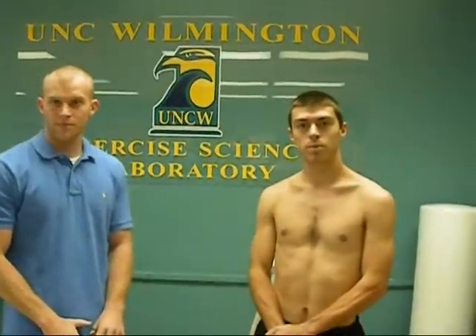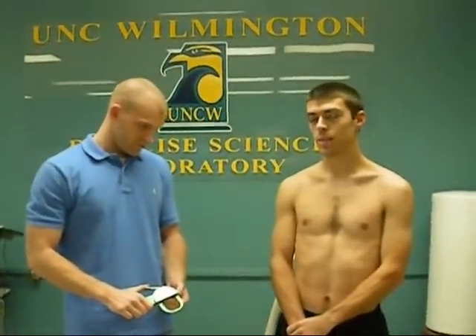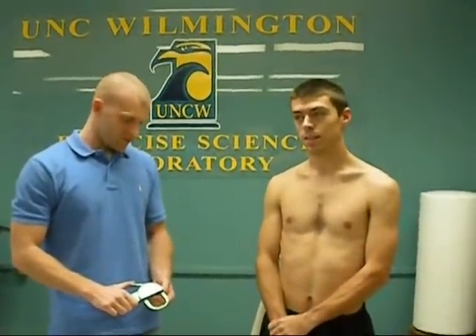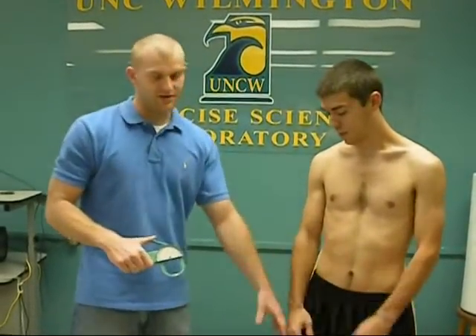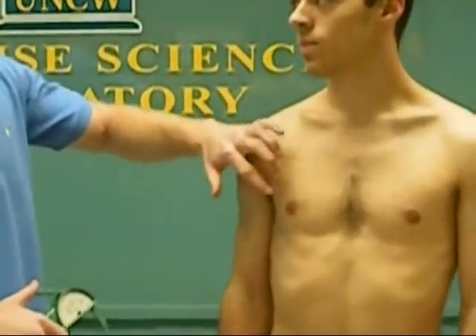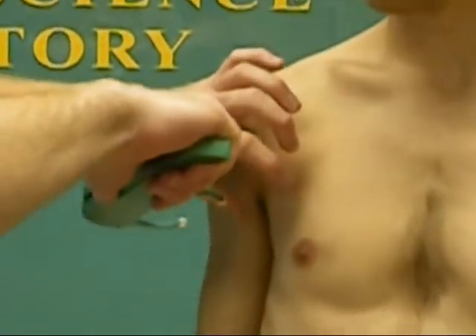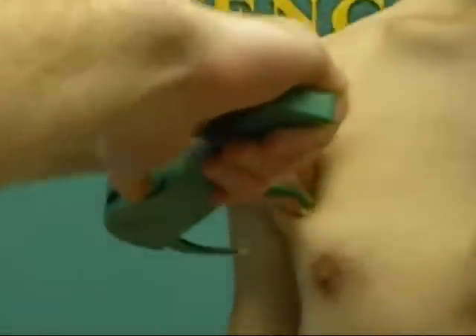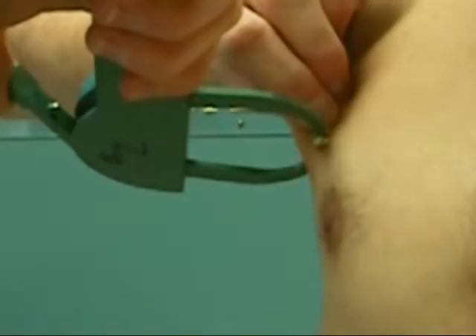Today we're going to take a skinfold measurement for males. We're going to use a skinfold caliper on the three-site system. For males, the three sites are the chest, abdomen, and thigh. For the chest, you want to start at the halfway point between the nipple and the axillary line. Pinch the fat, separating the fat from the muscle, then take the measurement.